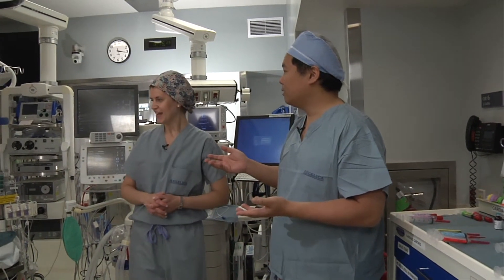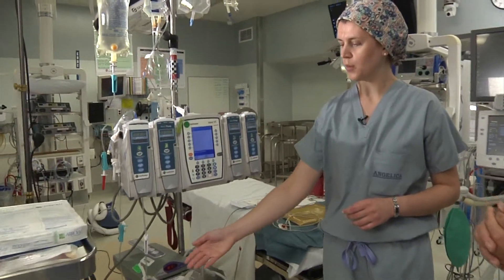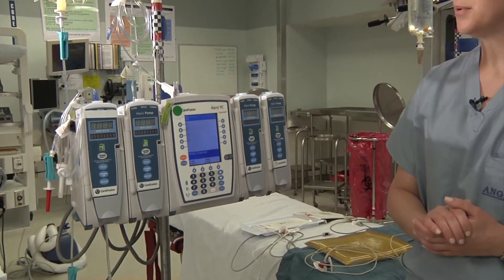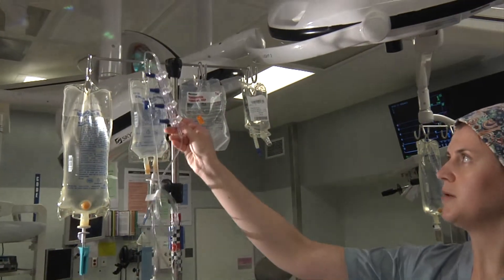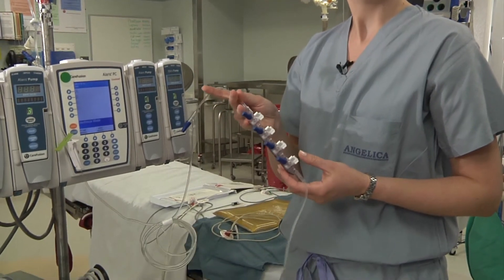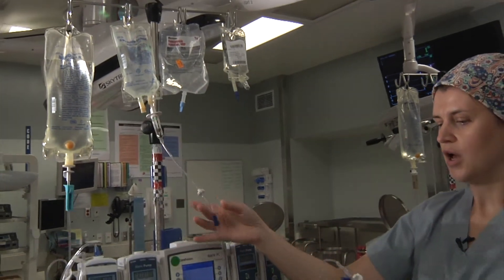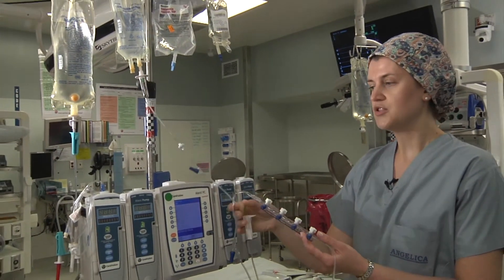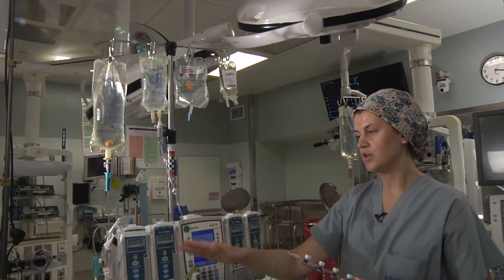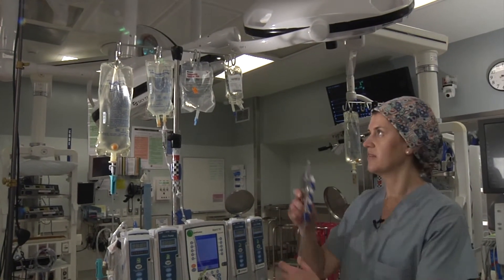Let's go to the left side of the bed. Here we have the fluid warmer set up, as well as the 4-channel Alaris infusion pump. Here we also have the VIP, which stands for vasoactive infusion port. Every institution might set this up a little differently. At the Brigham, we set up on a micro dripper connected to a gang of four; however, at your institution, you may program your pump to deliver a certain rate of infusion. Check with your attending before you set this up.